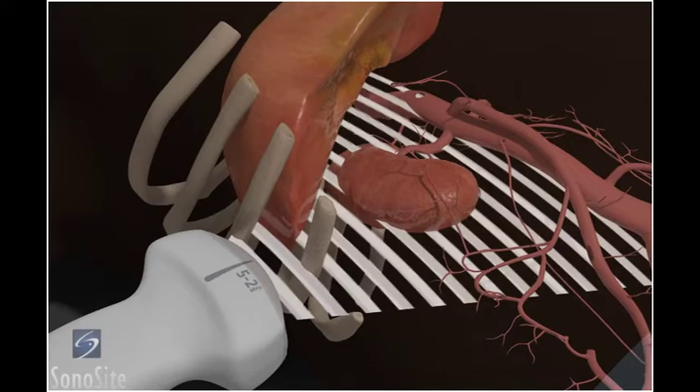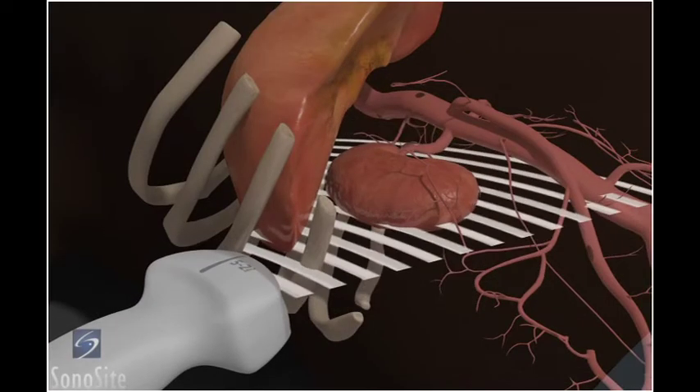Once the kidney is identified, the transducer is slightly rotated to adjust for the oblique orientation of the kidney.